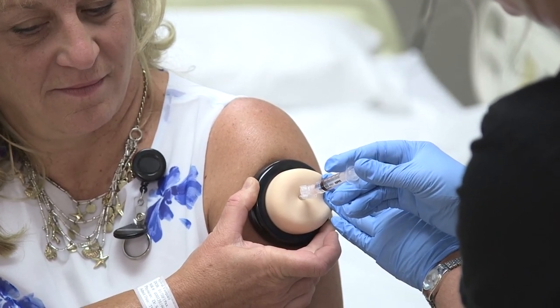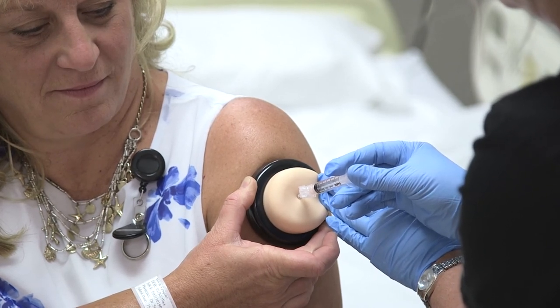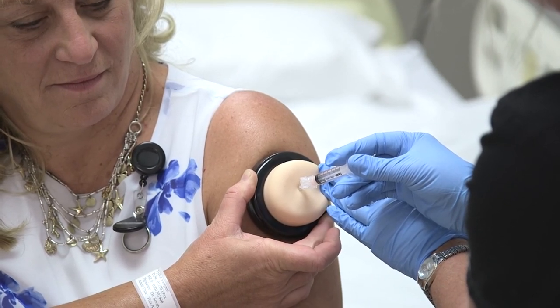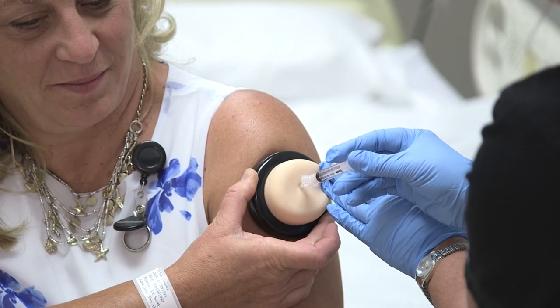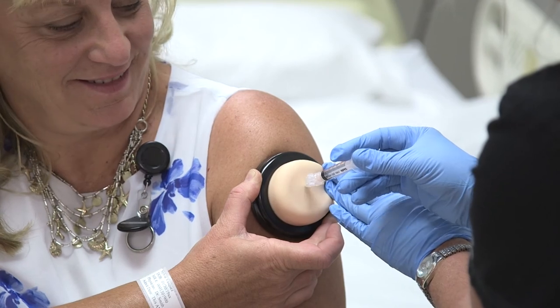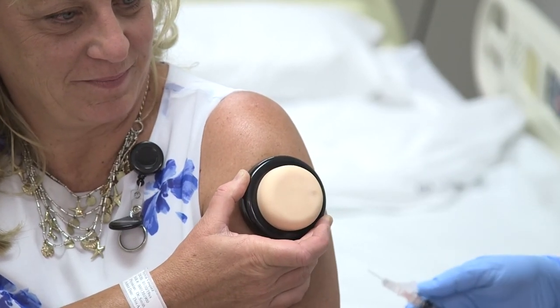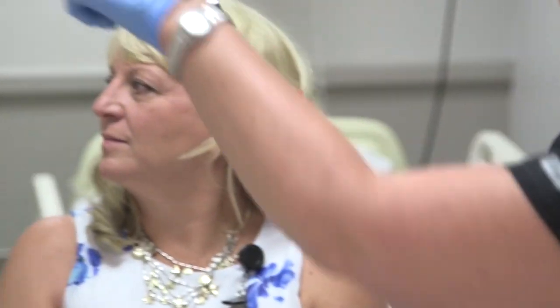All right. And then you're going to go ahead and keep holding for a second just to make sure all the medication gets in. And then you're going to, I can't remember, pause for a second. I think you pulled it just out. Pause. Yep. Okay, now we're going to pull out and let our skin go back over the injection site to keep the medication in. And I did engage my safety, which you want to do right away. And any sharps that you might have, you want to put in the sharps container.